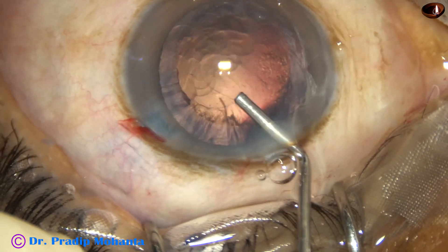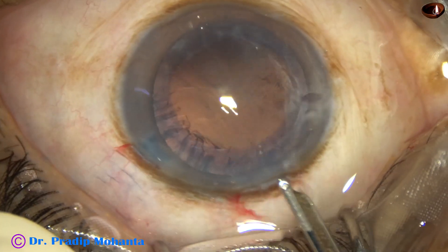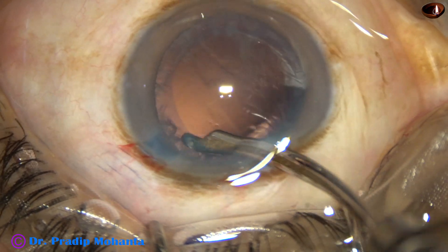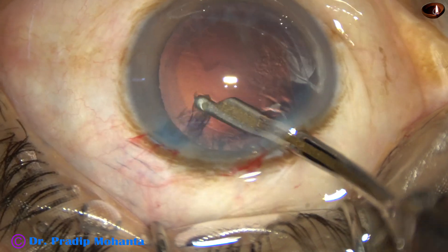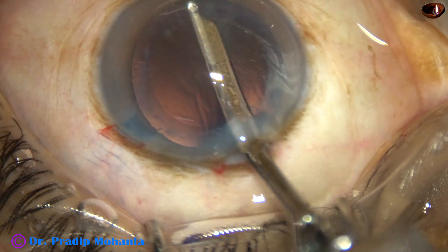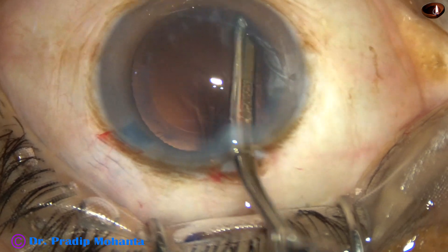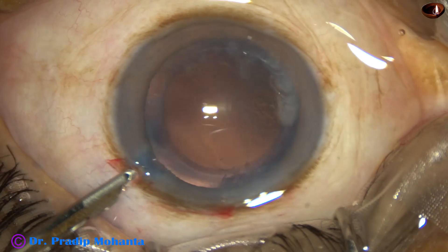Some visco is injected into the anterior chamber. Since there is only one side port, I am going to use a 23-gauge Simcoe cannula for removal of the cortical matter. The cortex has been nicely removed. I have to go through the left side port to remove the cortex from 9 o'clock to 12 o'clock.